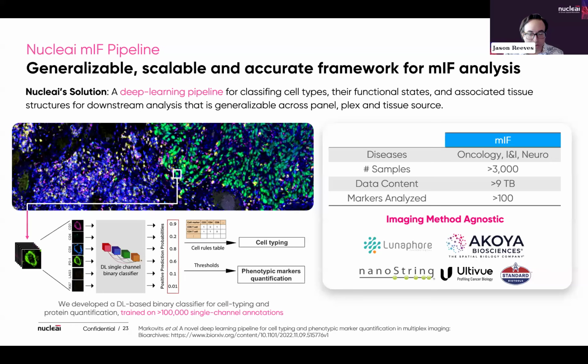And so the last particular type of methodology that could be in play is thinking about scaling this up even further. We've talked a lot about IHC, H&E, and multiplex, but at the chromogenic side of the house, we haven't talked a lot about immunofluorescence.